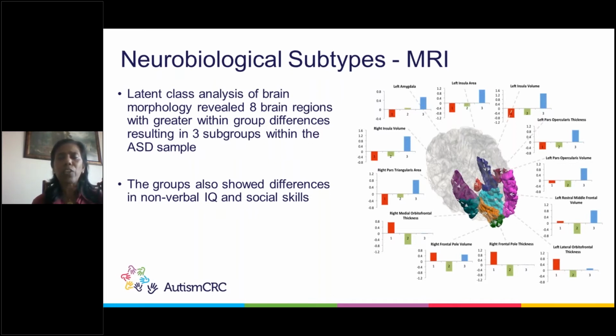So if somebody has reasonably good social affect scores on an ADOS, and if we find that they have good activation on the fMRI and the NIRS when they are watching that social stimuli being played, you can be pretty confident that an intervention using social sensory routines and motivating them through that area of the brain is a good possibility.